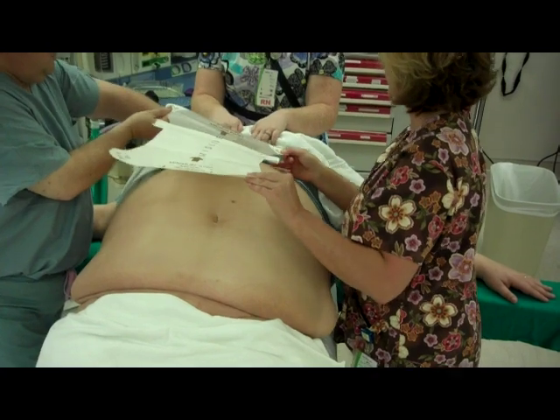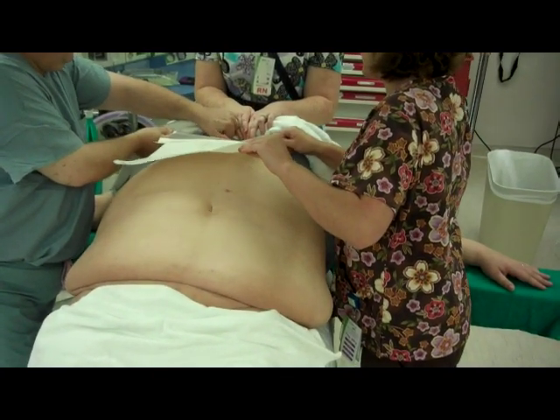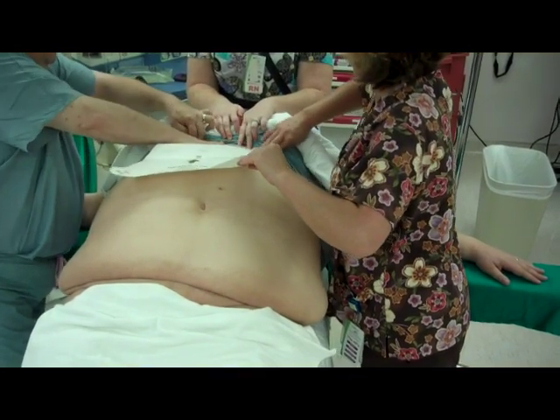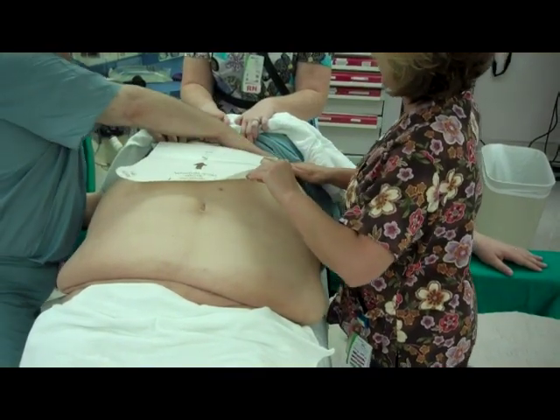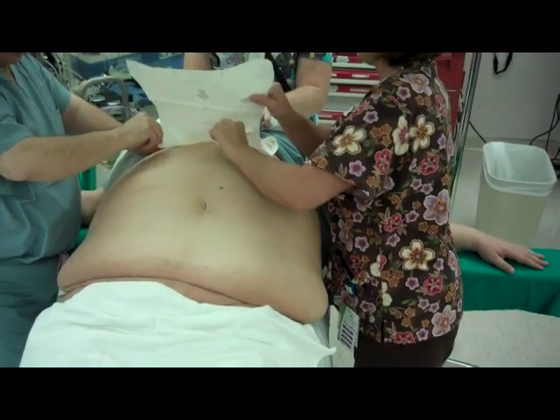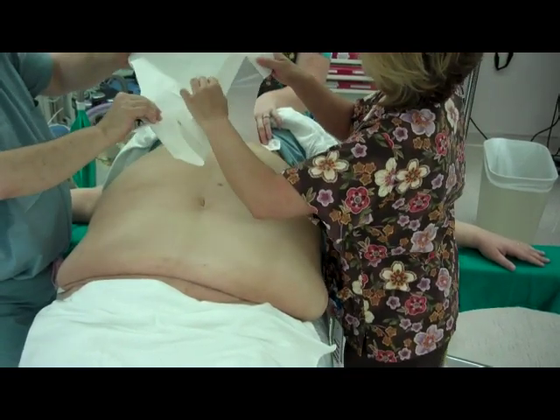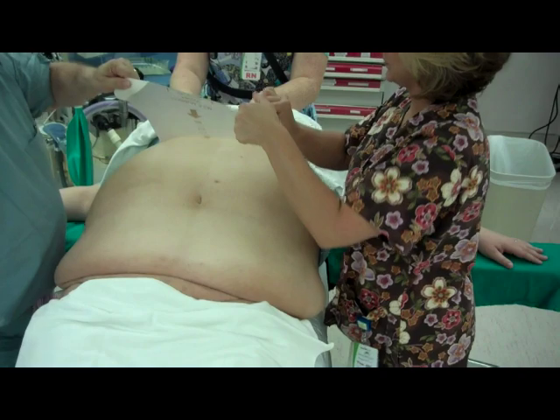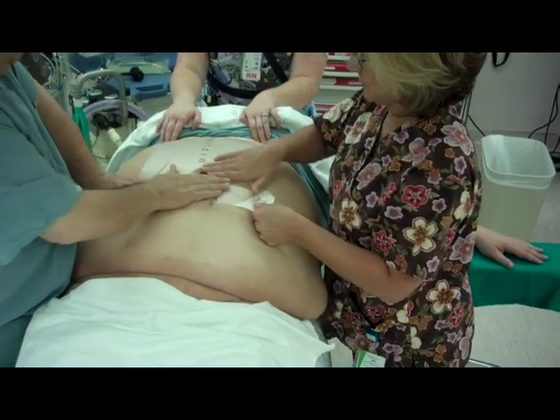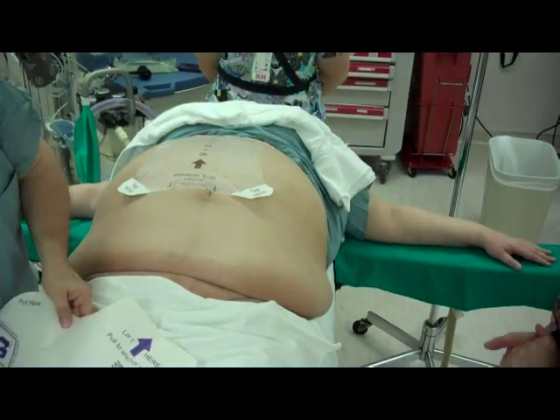Remove tab A. Apply midline near the xiphoid, under the patient's breasts. Smooth onto the skin. Now remove panel B and smooth down the patient's skin toward the umbilicus. The extender is now in position to accept the pH 25.